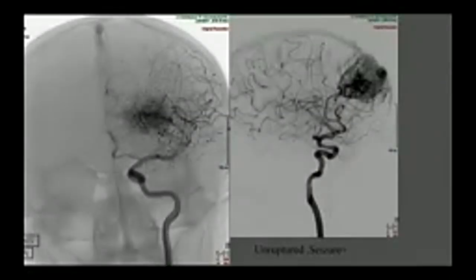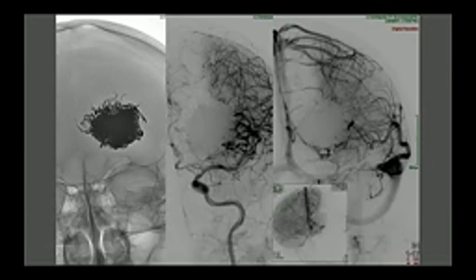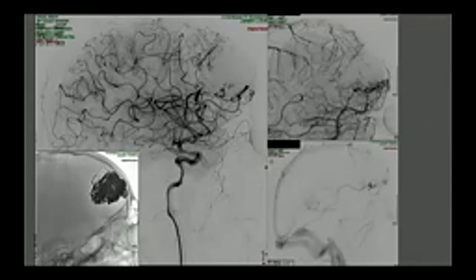And then Onyx appeared, and after having Onyx, because it is actually a non-sticky material, we started to inject more than expected. And even from one single microcatheter, we were able to treat such huge nidus from one single catheter. And then we are getting more and more complication. Whenever the AVM is getting bigger, the results are getting worse. Such images, for example, around the nidus, immediately after occlusion, we started to see such stagnation. At the beginning, we don't realize are those veins or arteries.